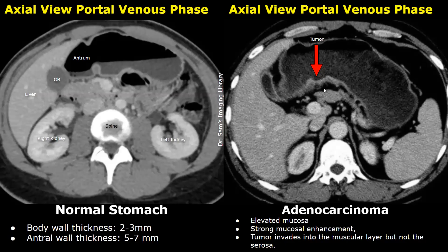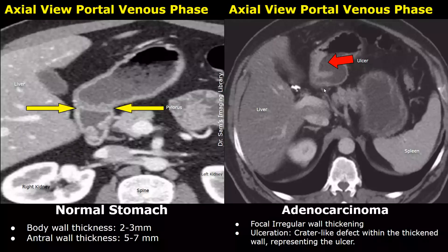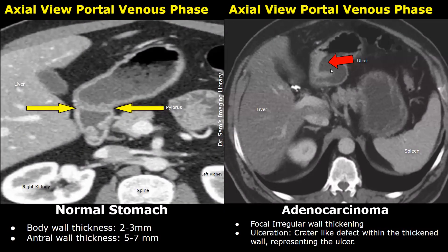This is another image showing an irregular focal wall thickening in the stomach. If the wall thickening or mass shows a crater-like defect — a concave-shaped defect — it usually suggests ulceration. You can see this concave-shaped, crater-like defect within the tumor; this type of appearance suggests ulceration. This is an ulcer.